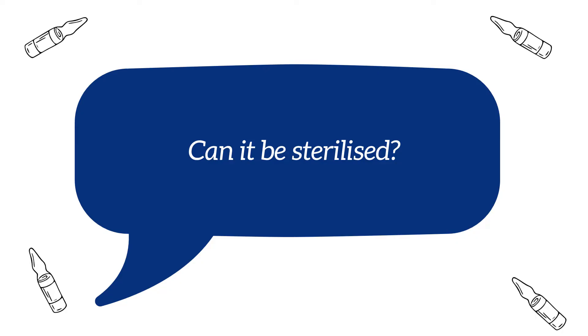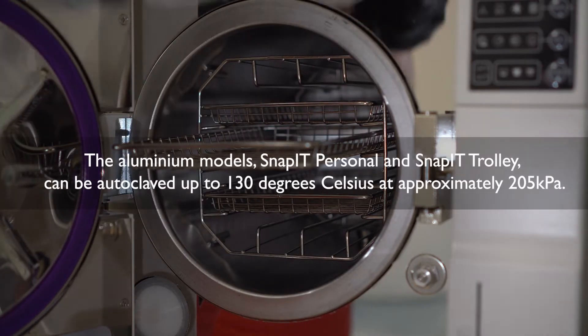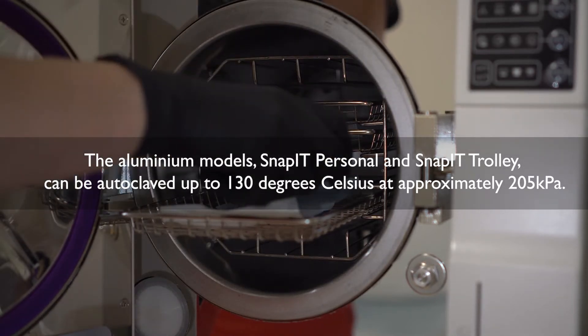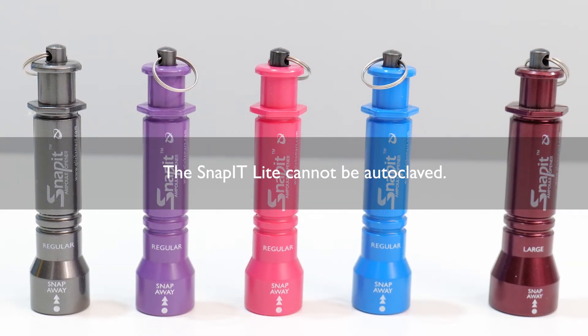Can it be sterilised? The aluminium models SNAP-IT Personal and SNAP-IT Trolley can be autoclaved up to 130 degrees Celsius at approximately 205 kPa. SNAP-IT Light cannot be autoclaved because it is made from lightweight plastic.